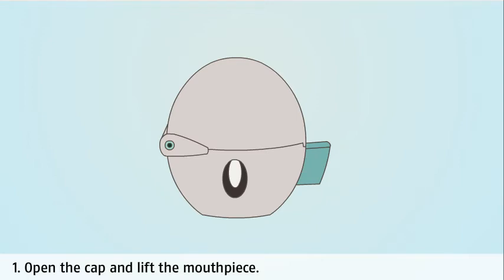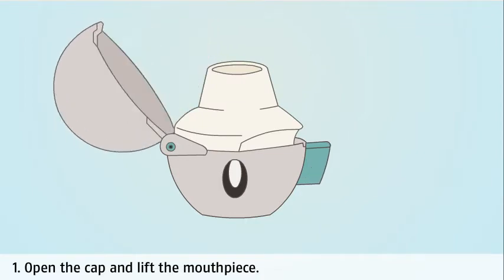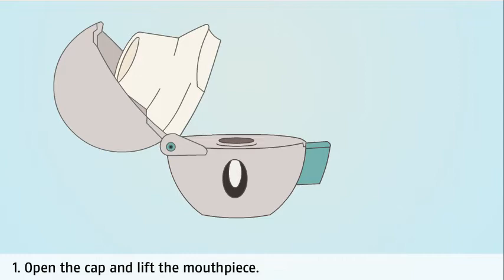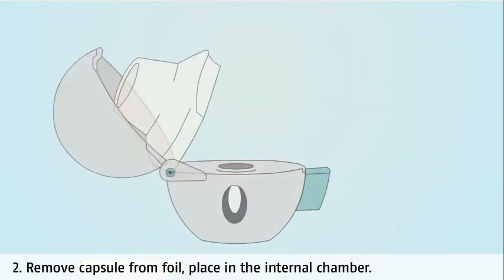Open the cap and lift the mouthpiece. Press the Handihaler piercing button to release the dust cap. Pull the mouthpiece upward to reveal the chamber where you will insert the medicine capsule. Remove the capsule from its foil and place it into the internal chamber.